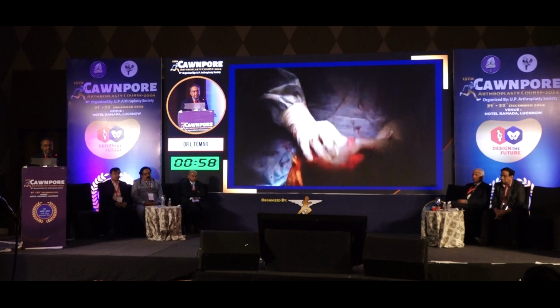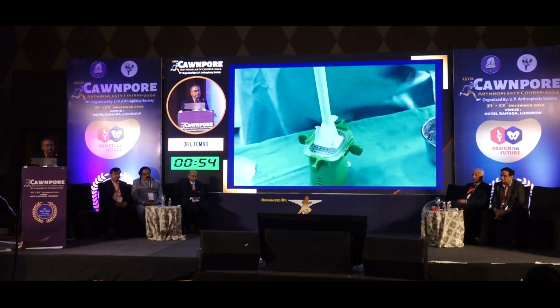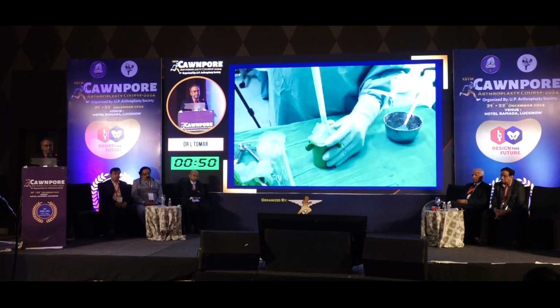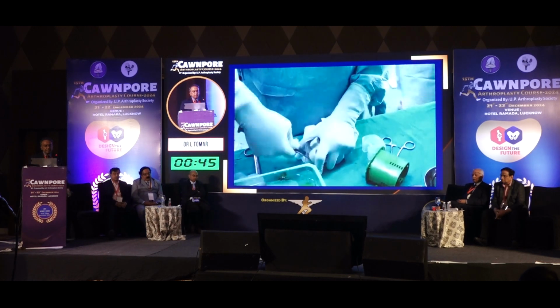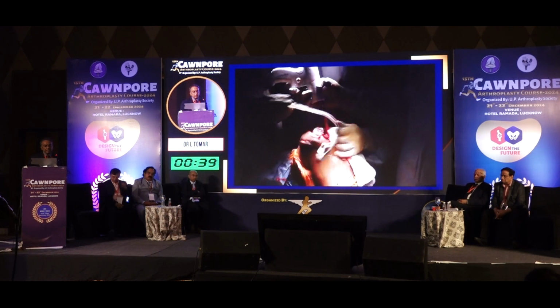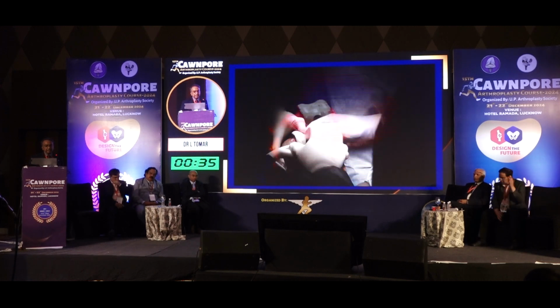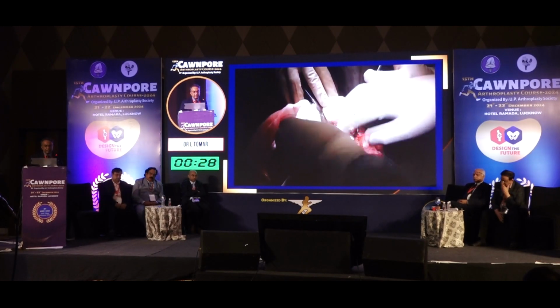After we look for the tibial thickness, using the same antibiotic loaded cement, we prepare the tibial articulated spacer. In the meantime, we clean the raw areas of the bones, dry them out, and after proper cleaning, we check again. We apply the spacer in trial mode and look for the stability of the joint, and also for patellar stability and patellar tracking.